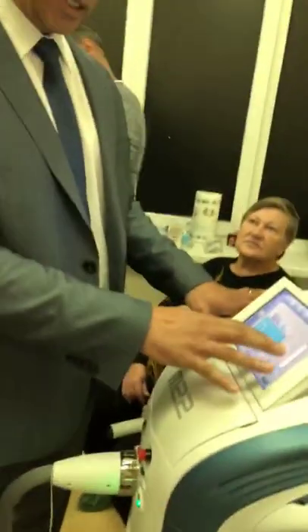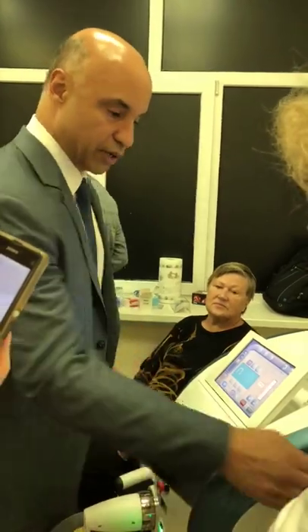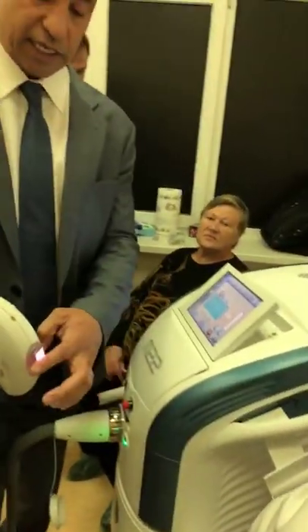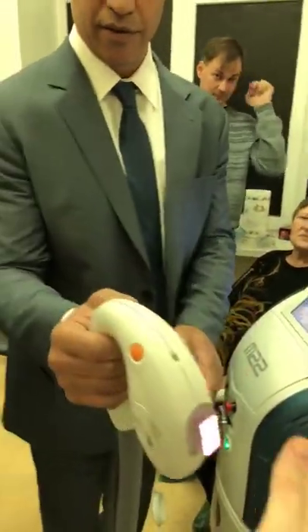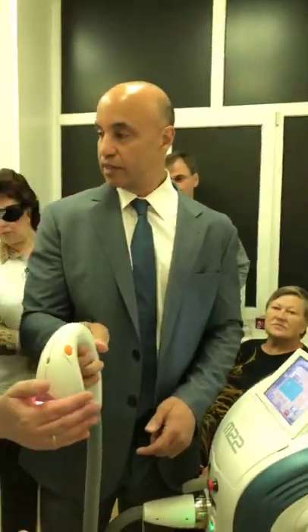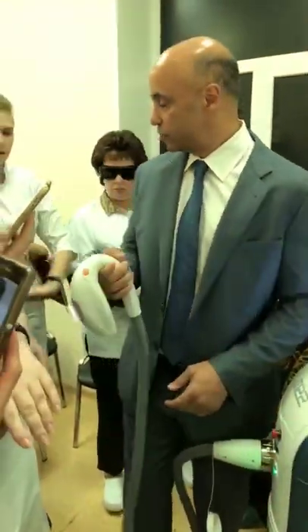So here's the opening screen. This is intense pulse light. This means that the chiller is going. So it's saying that this has a cooling plate. Do people want to feel that? This is so that you don't burn the skin. Все прохладно.